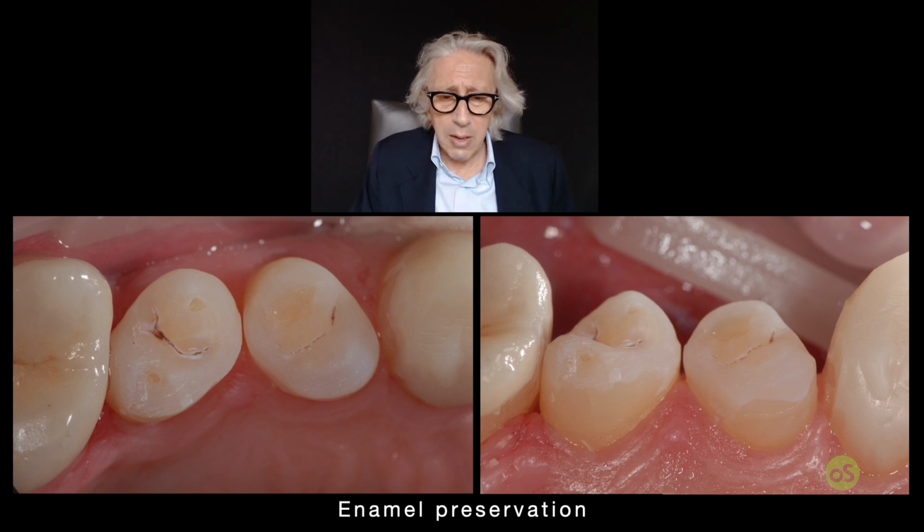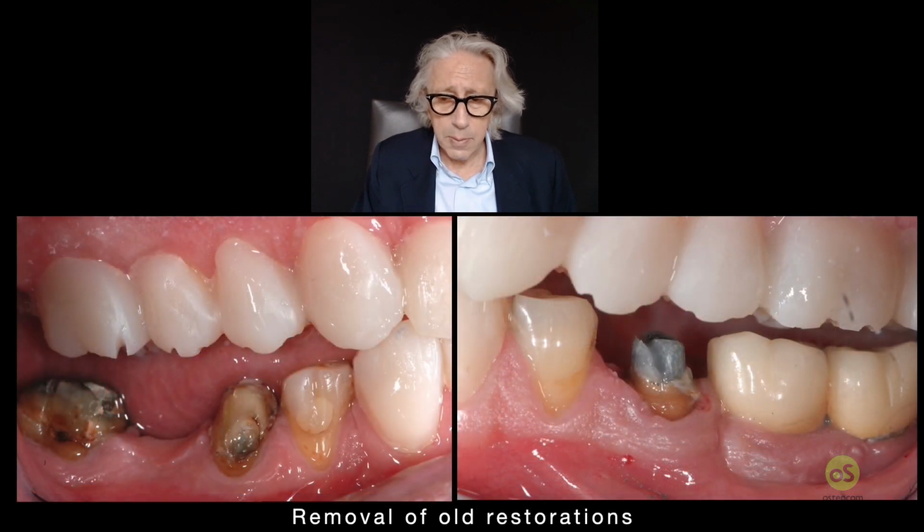We just kept the enamel, we just refined a tiny bit, but we kept the enamel that was still present there. There was not so much enamel, but anyway, in this case it's quite a lot actually, though not so favorable in every tooth. But the enamel that was present was kept 100%, because of course we have already lost some volume of teeth and enamel. So we want to keep the enamel that was still there to be bonded.